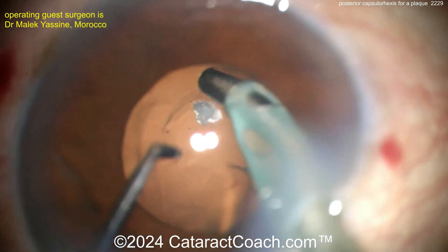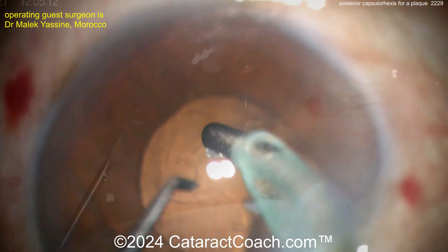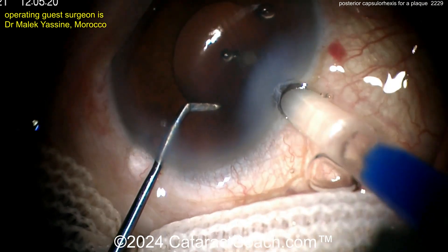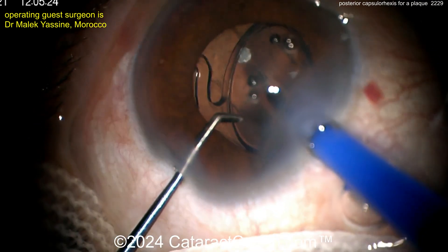There it is. Sometimes you can just peel it off, but sometimes you can't. Could you just leave the plaque there, put the lens in, and do a YAG capsulotomy later? Of course — that's a very reasonable thing to do also.